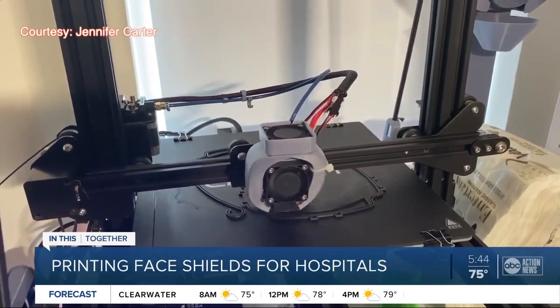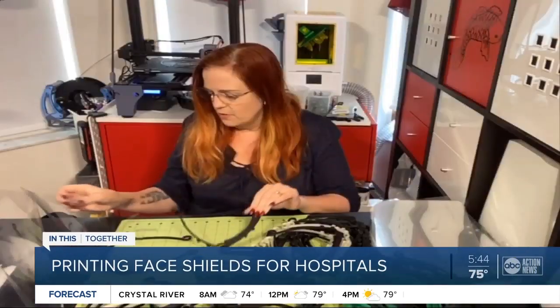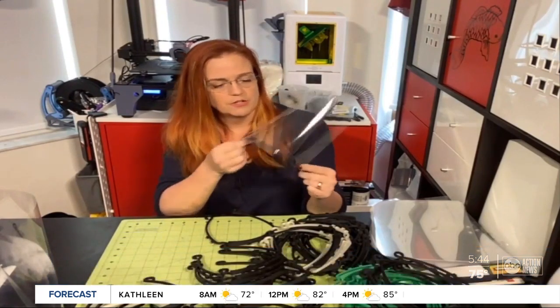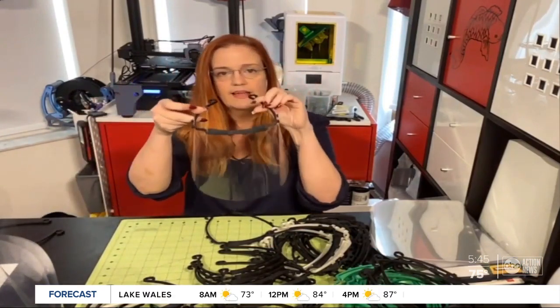This is one right here — a face shield Jennifer Carter made on her personal 3D printer. Then what we do is we take these binder cover sheets, basically, that the NIH has actually said this is what you need to use, and they just pop on these pegs, and then you have your finished one, like that.